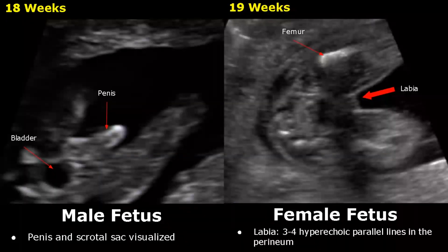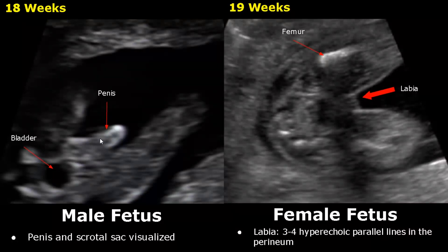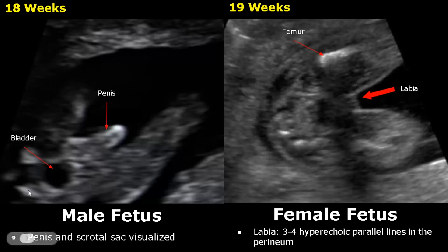Here we have an image of 18 weeks. We can see the penis and the scrotal sac as well. This small dome-shaped structure is the scrotal sac. We can also see the bladder here.